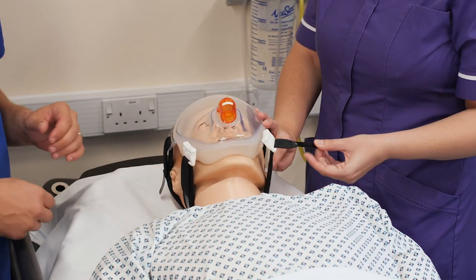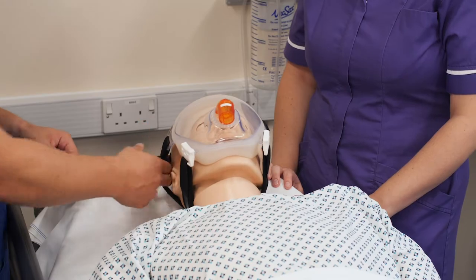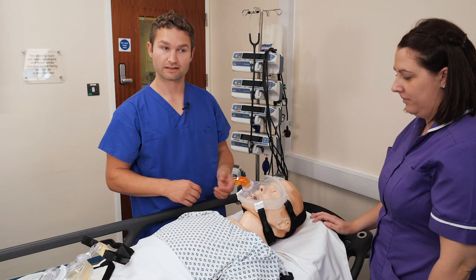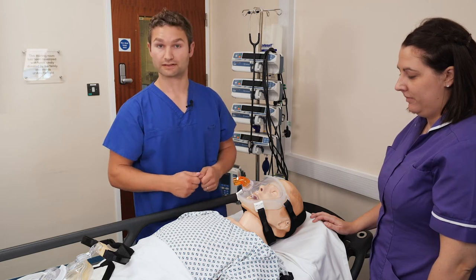Once you've tensioned each of the straps, you can then check that they're not too tight by running two fingers underneath the strap itself. Sometimes with mask designs, you may get a small amount of leakage from the side of the mask. Many non-invasive systems can compensate for this leakage, so don't be tempted to over tension the straps.